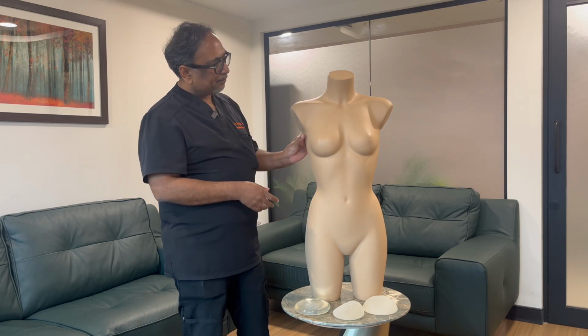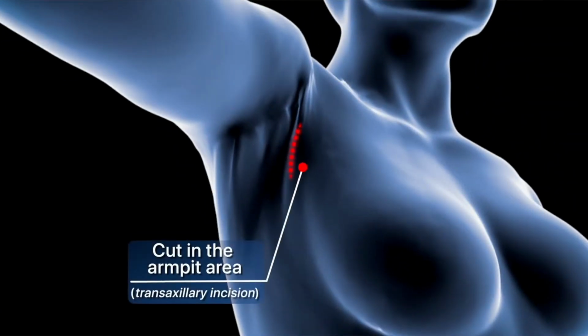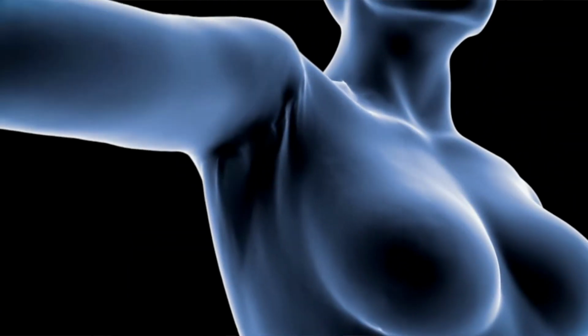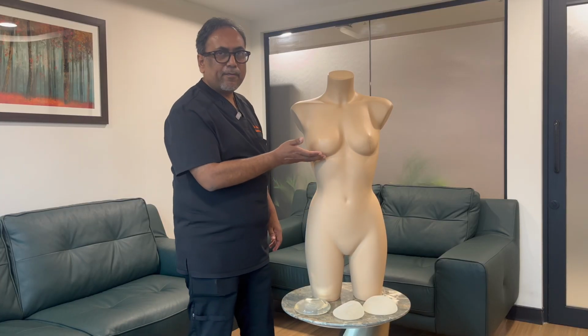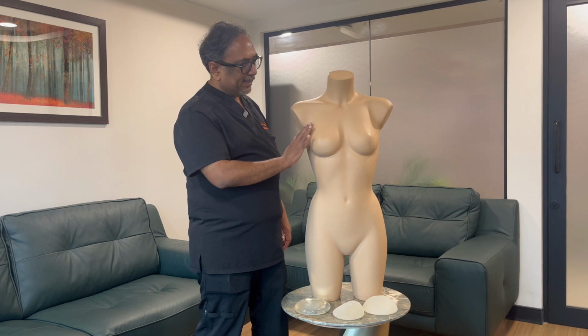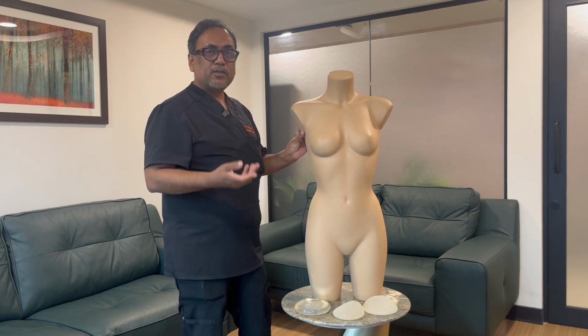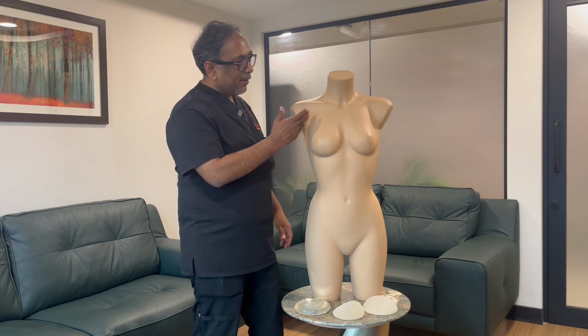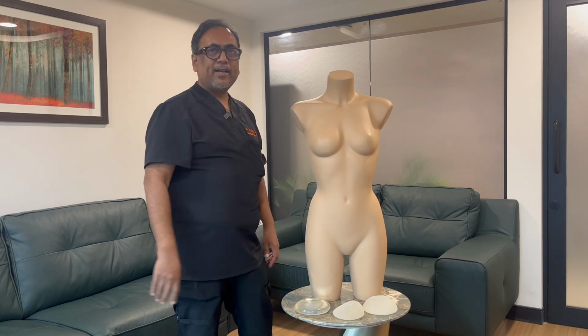The least considered is the axillary incision. Why it is not in real vogue is because you cannot really control the inframammary fold precisely by the axillary incision. Although surgeons who are experts may prefer this route, you need an experienced surgeon to do the axillary technique.